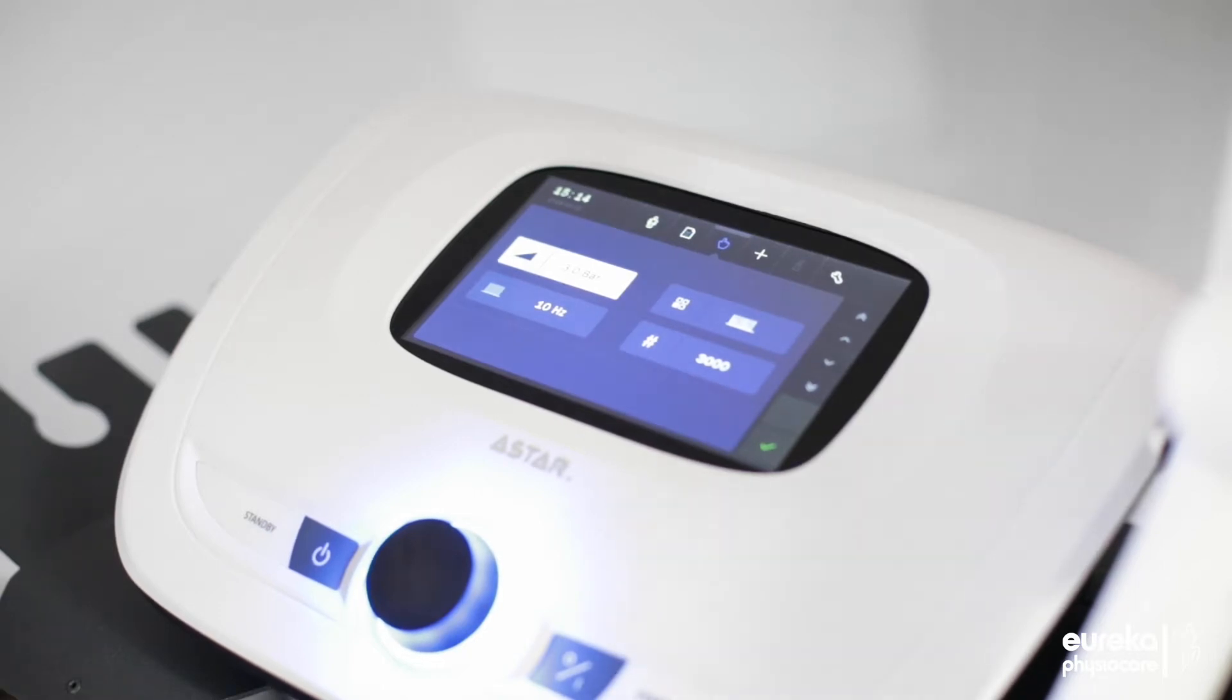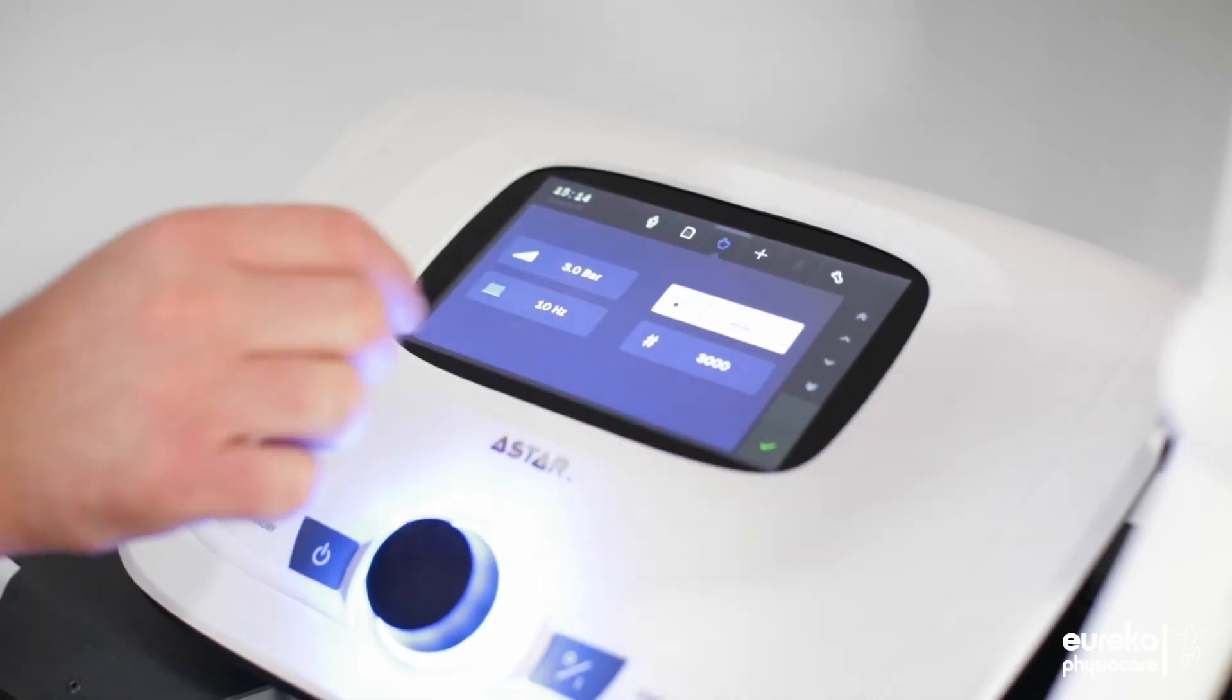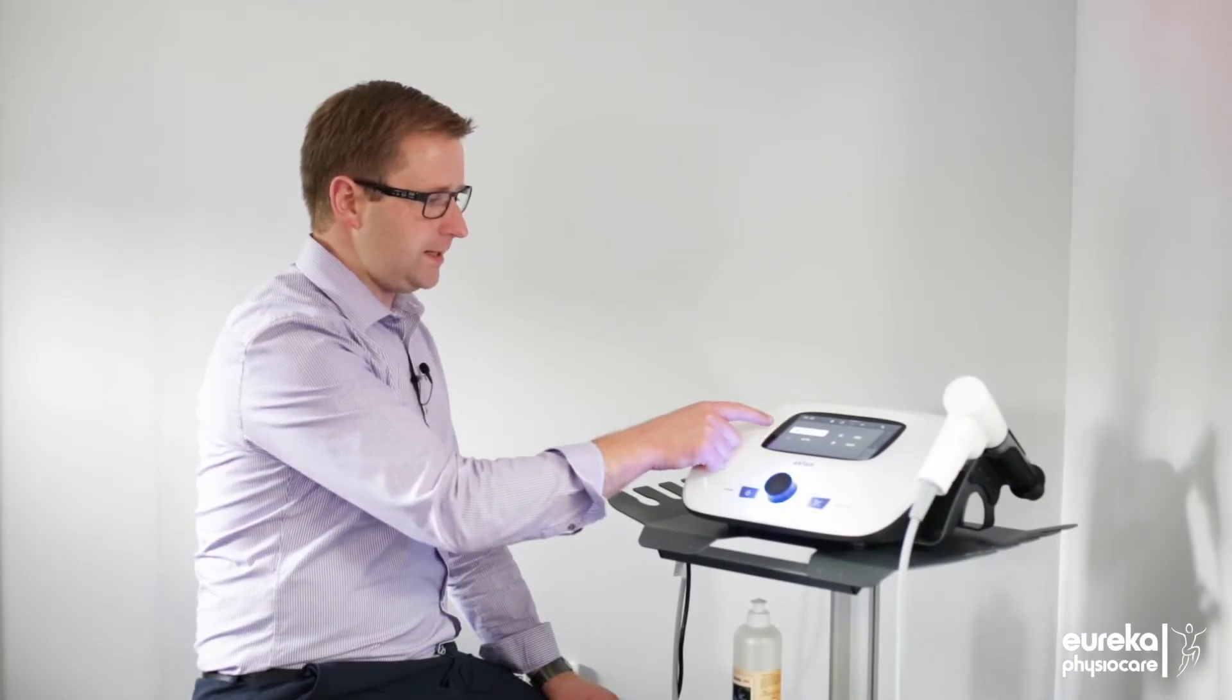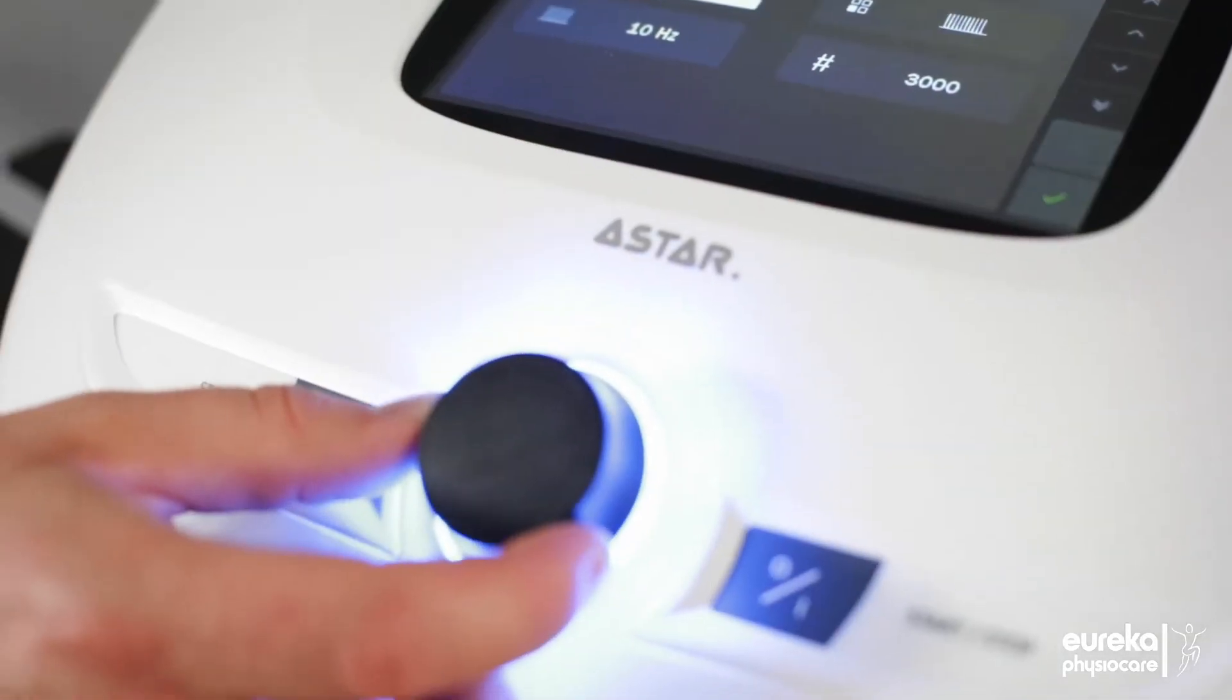This here is your home screen where you have the manual mode showing the bar pressure, the frequency, the number of shocks, and the pulse emission mode. Each of those can be adjusted independently by selecting them and turning the dial up or down.